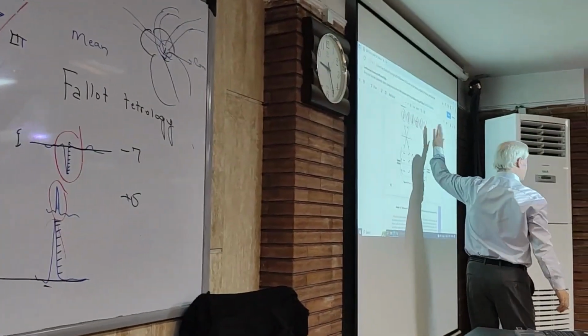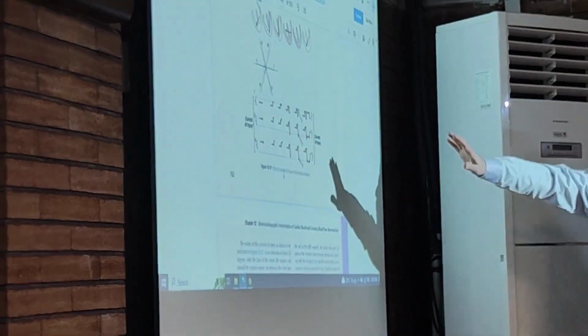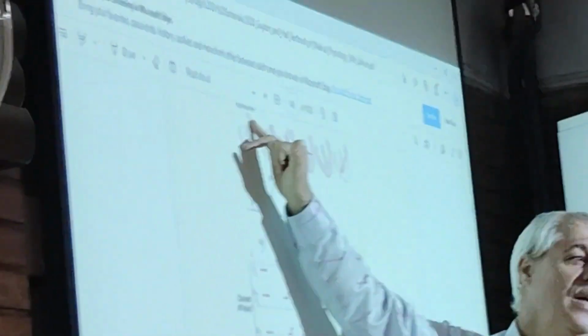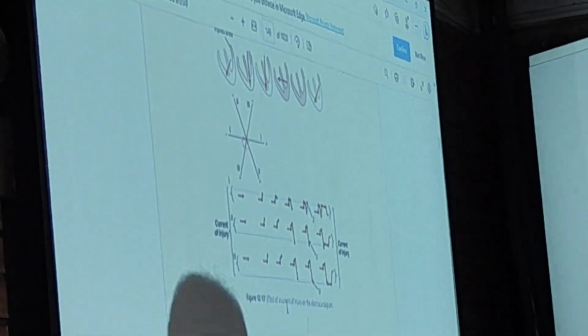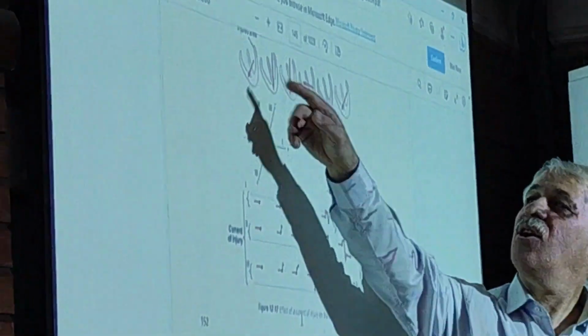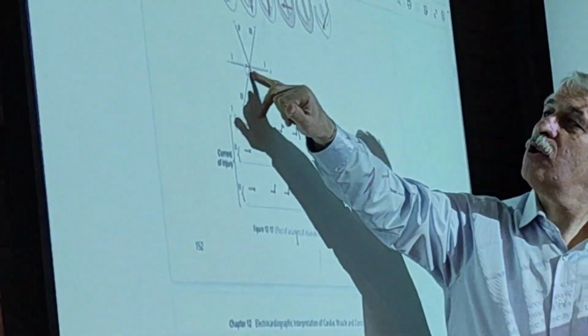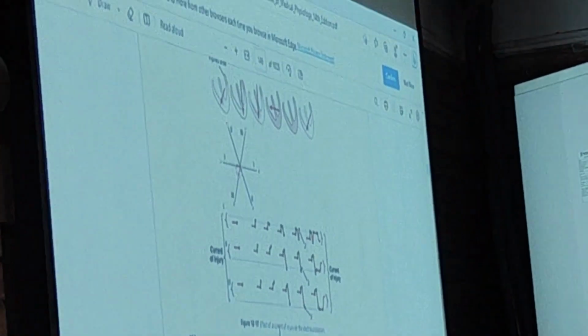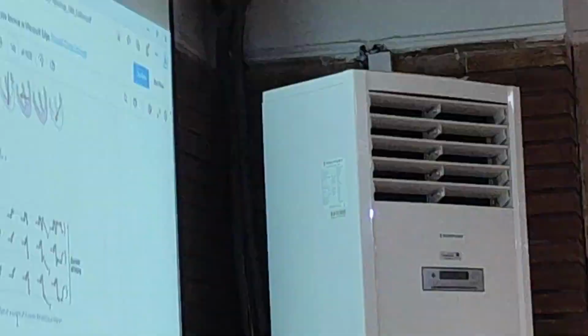Take a look at the picture here. At rest, see, this is at rest. Part of the lateral wall of the left ventricle is infarcted, which means it is always in a depolarized state. So at rest, take a look. This area in limb lead 1, you should make a vector. You see the mean vector in the normal heart starts from the base to the apex.